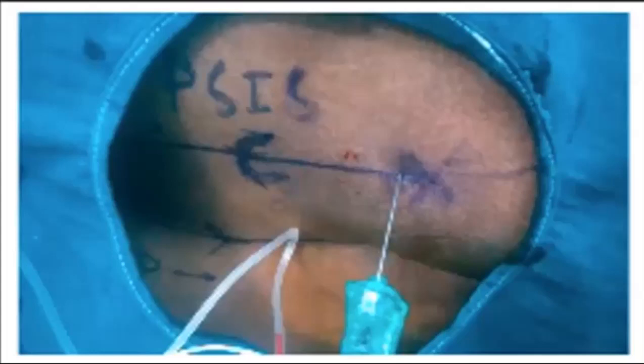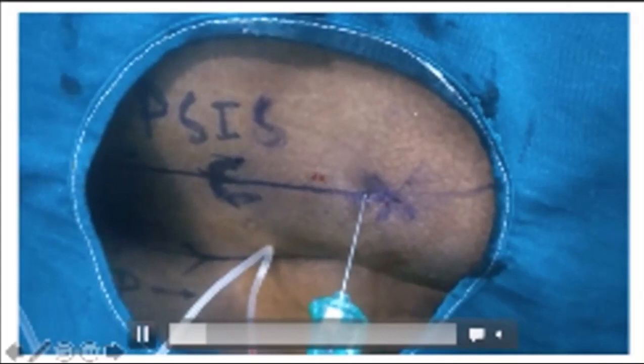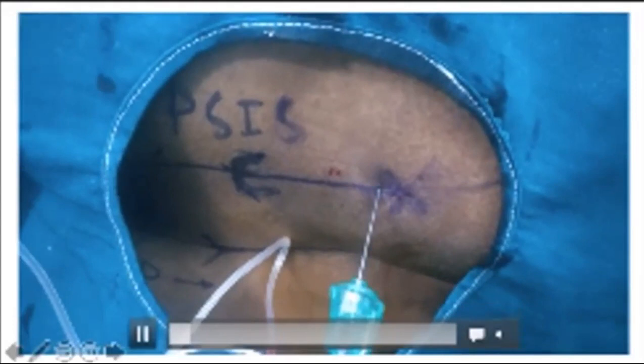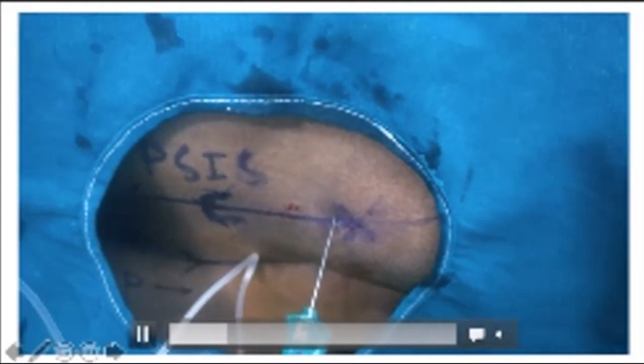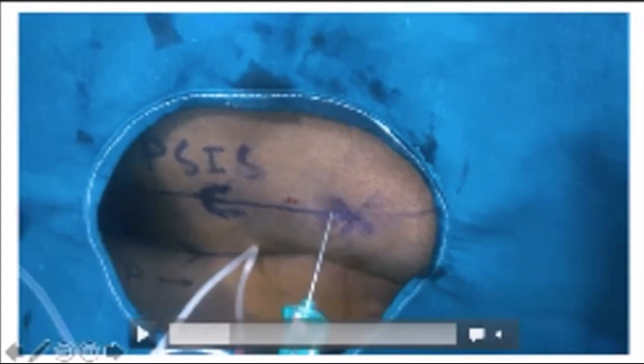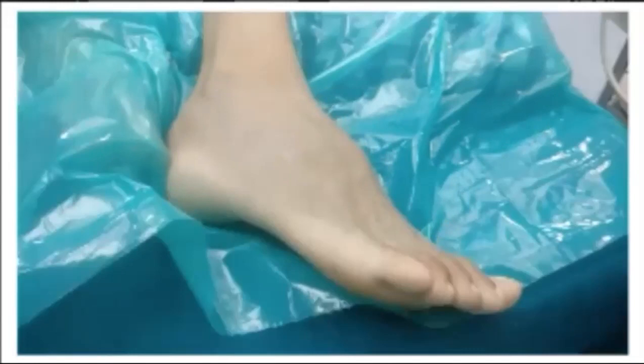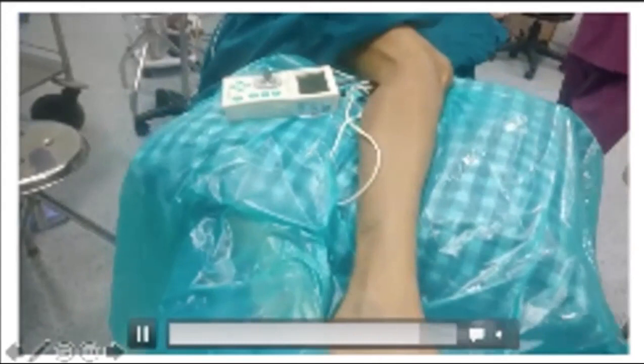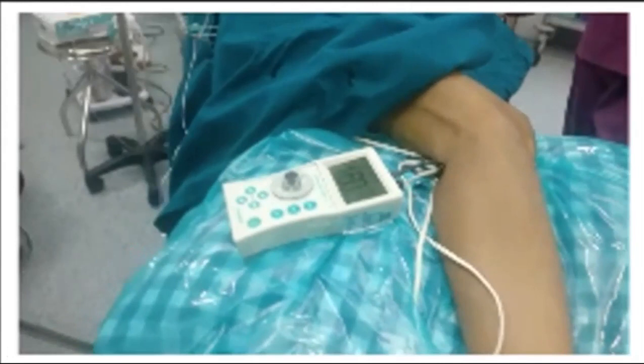Now look at this sciatic block. Here we have used Mansoor's approach - six to seven centimeters - and we struggled here. You can see some blood in the tubing, which clearly shows we had difficulty: there was initially blood in the syringe and the set, and then we repositioned. We may have injured a vessel. After repositioning, we got a good twitch - a nice sciatic response - and deposited the drug.